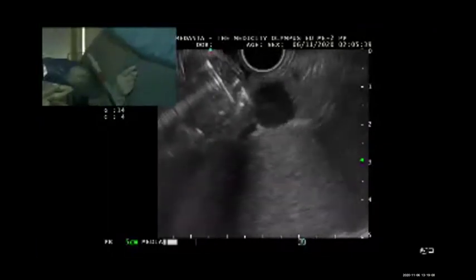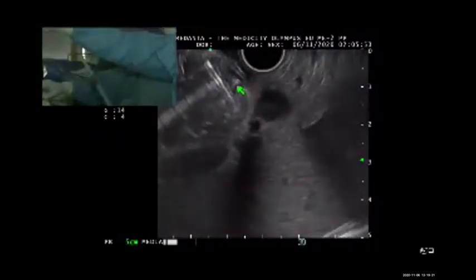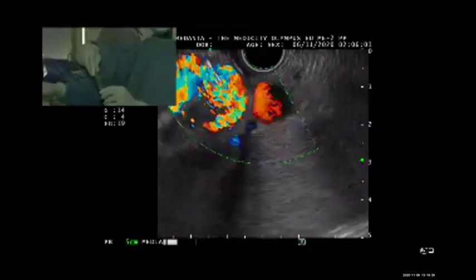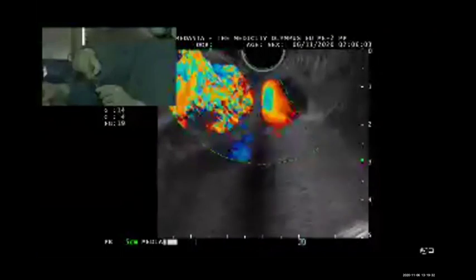Can you suck the blood again once? Can you make the sedation a little bit better for the patient? Yes, blood. Can you see my needle is inside? Yes. You see, the blood started coagulating around the coil. Can you see the EUS image? So I prefer to use one coil only. Is that okay? Can you show with the marker? You see the blood started coagulating around the coil. Flush. Apply the Doppler. You see the flow is less?